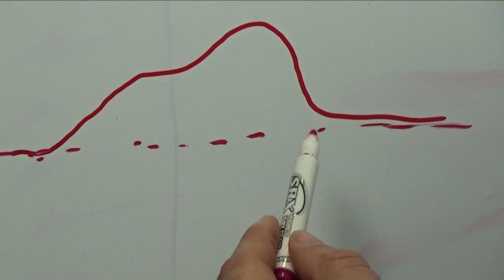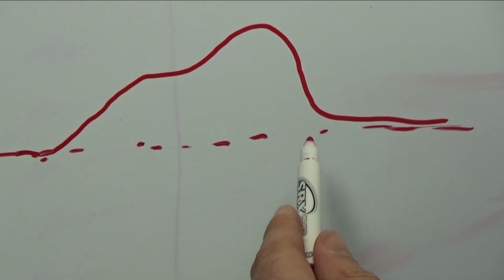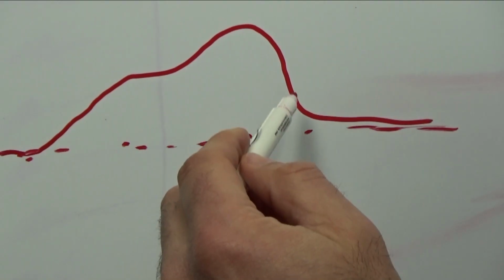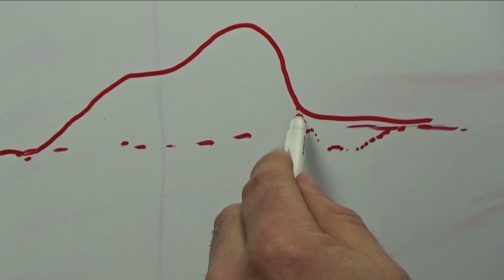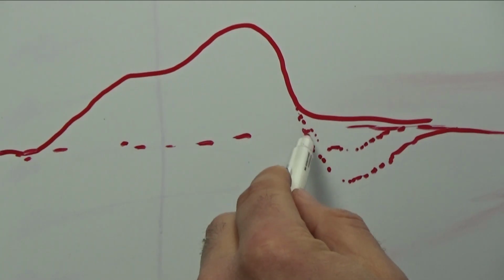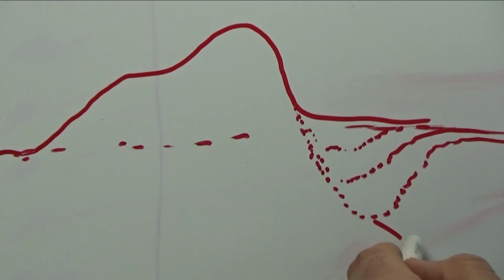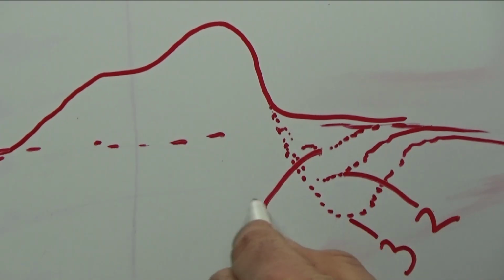And we're always trying to achieve the same pressure with CPAP. What happens with EPR is on the exhale, to make it a little bit easier during this phase, you get it dropping actually below the pressure. So EPR at 1 would be like this. If you go EPR 2, it would be like this. If you go EPR 3, it drops it like this. So you're getting these huge decreases. So this is the most at 3. Remember, this one was 2, and then this one was 1.